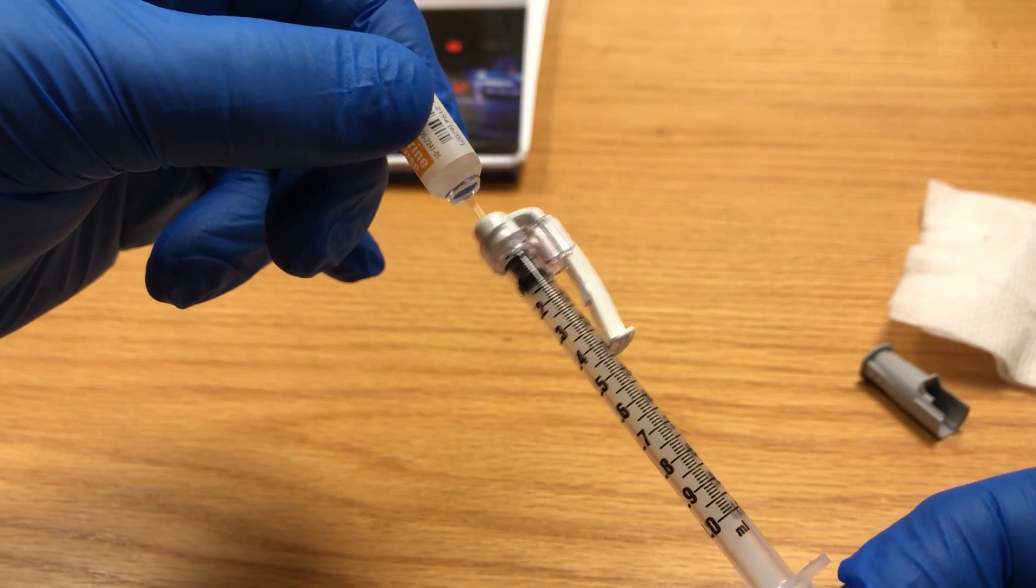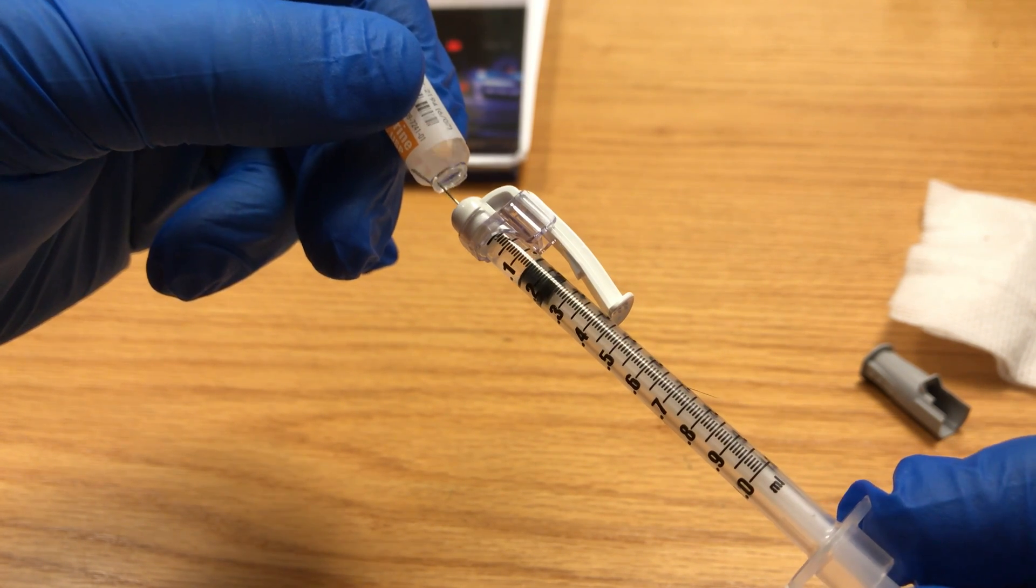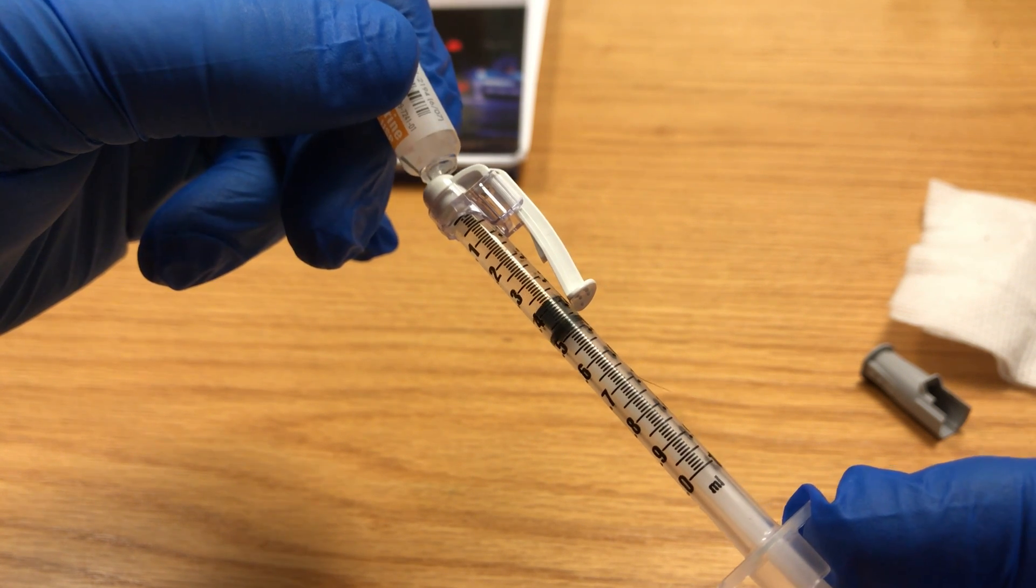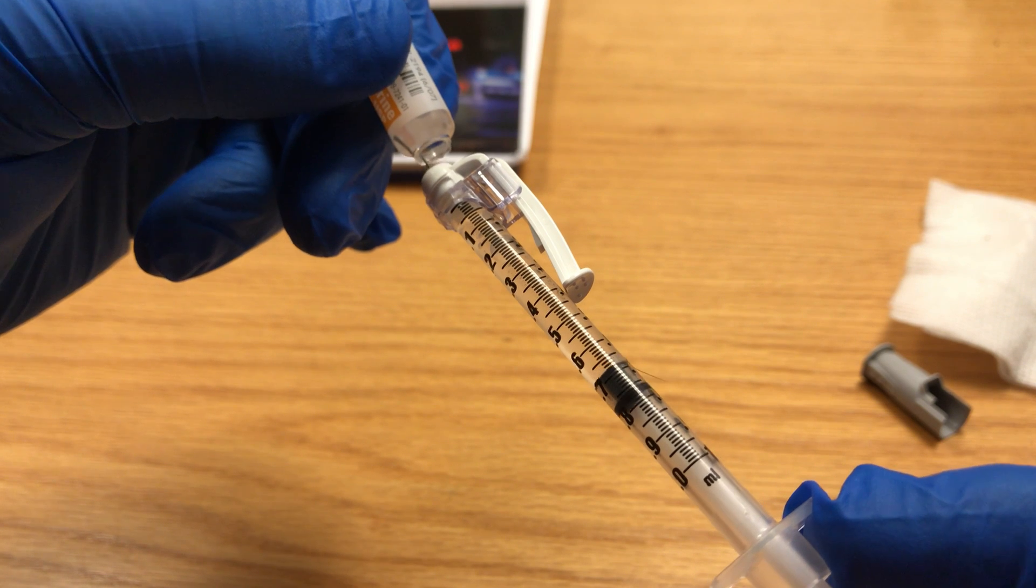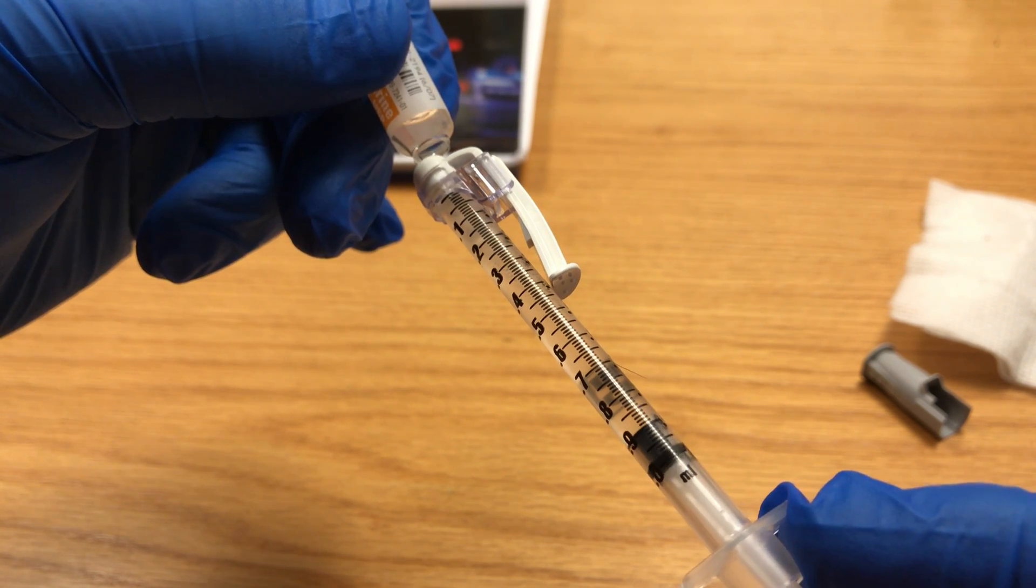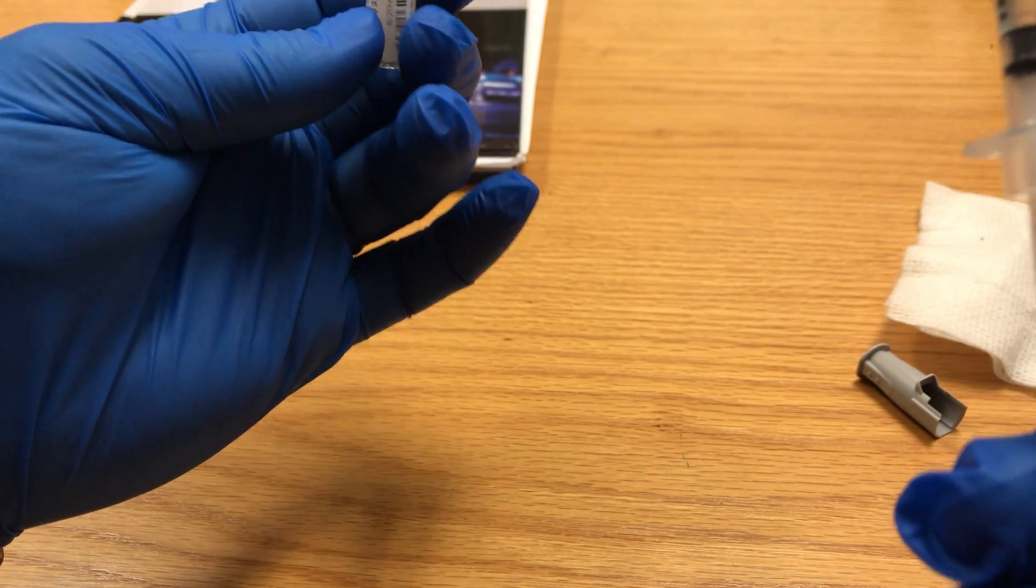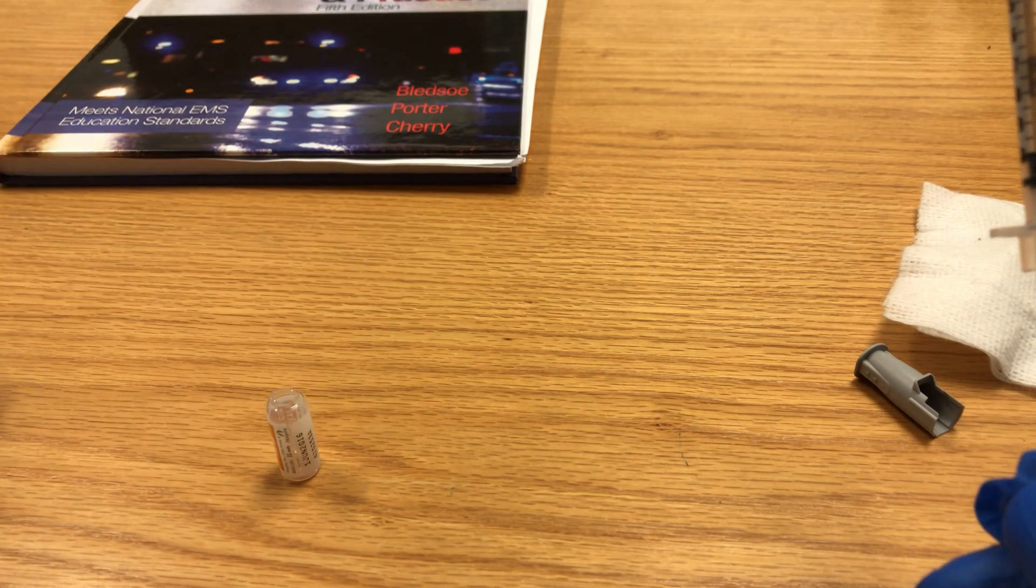You'll see the air starting to go in as I pull the medicine out, and this way I can get all of the medication out of the ampoule that I would need. Then I would give it to my patient and dispose of all of this in the sharps container.